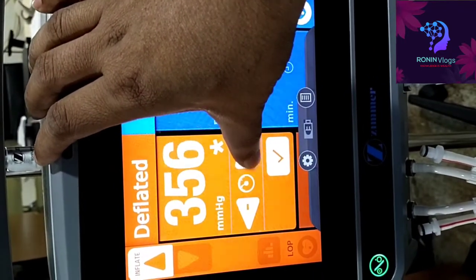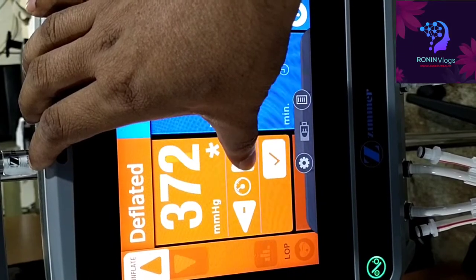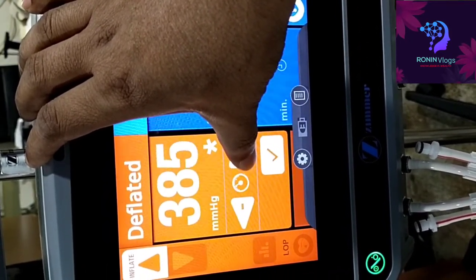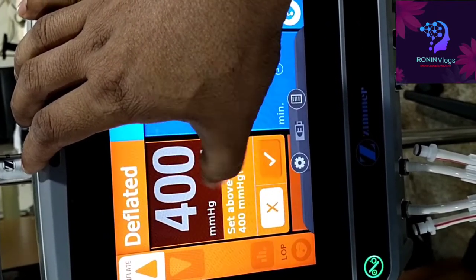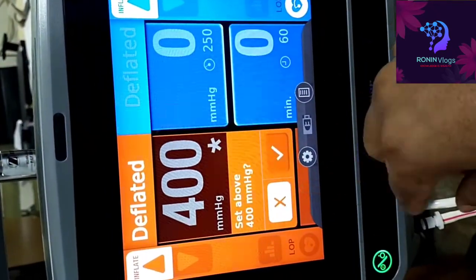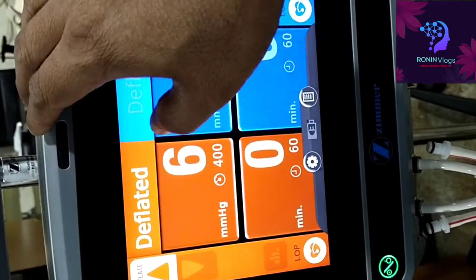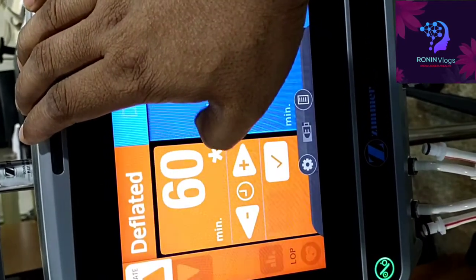This one has high air pressure, 400 mmHg. We need to select okay like that. Now how much pressure the surgeon wants, we can set easily.